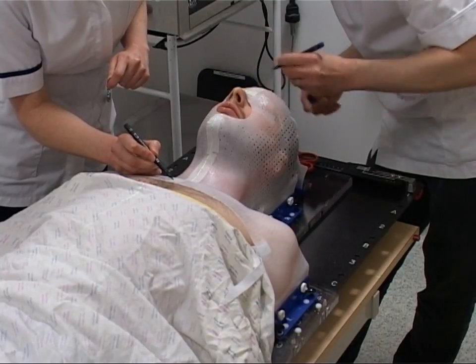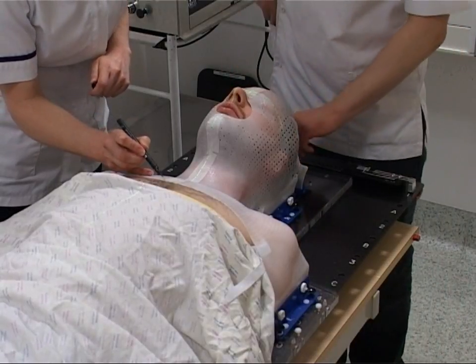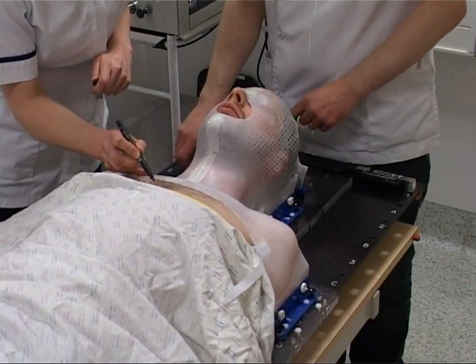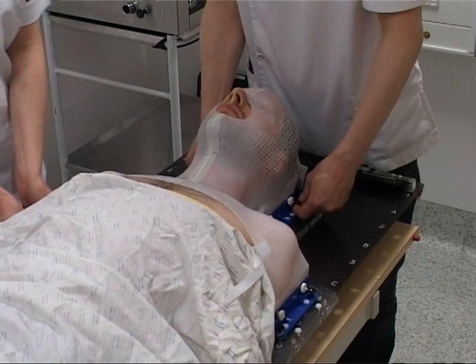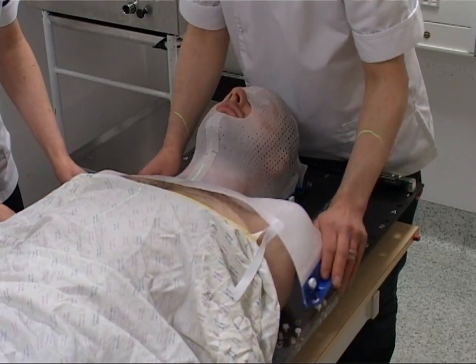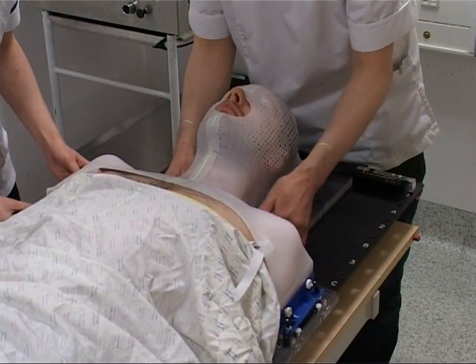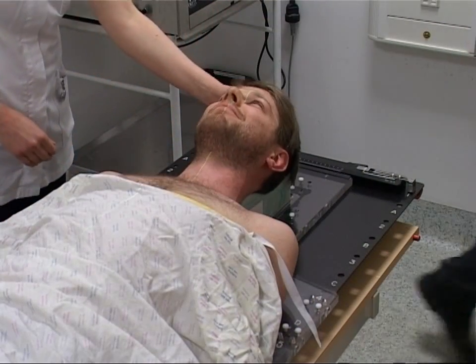There will be a couple of little dots just underneath the mask on your chest. Then the mask is removed. All done.